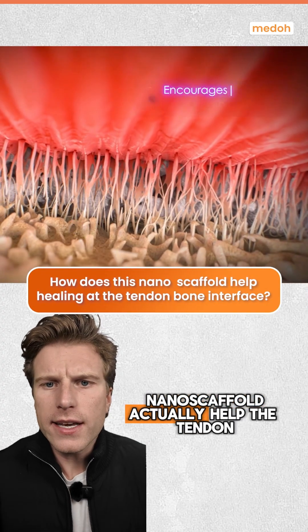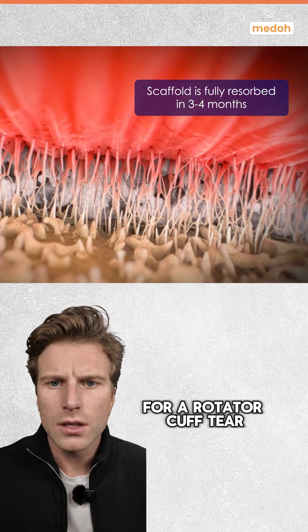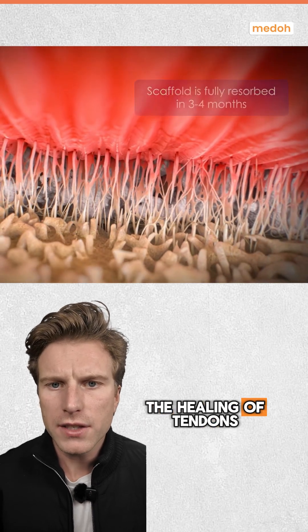So how does this nano scaffold actually help the tendon heal back down to the bone for a rotator cuff tear? This is Rotium, and it's developed by Atrion Orthopedics. It's taking a very different approach when it comes to the healing of tendons.